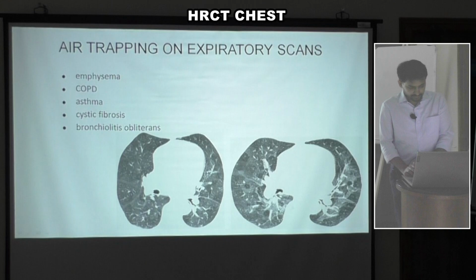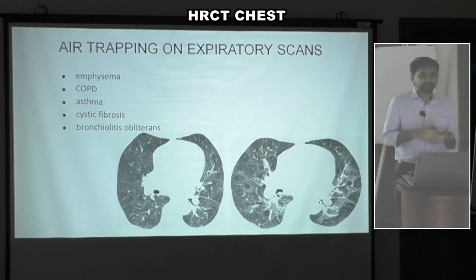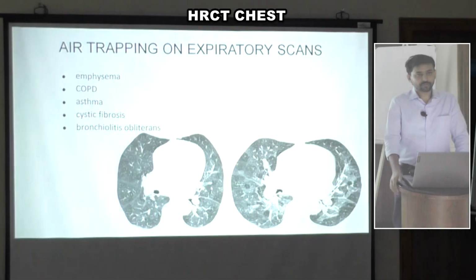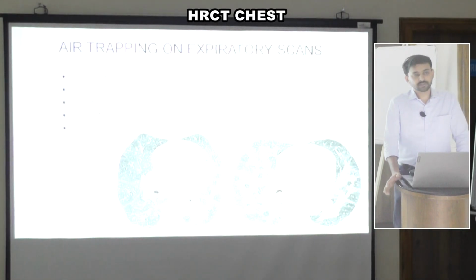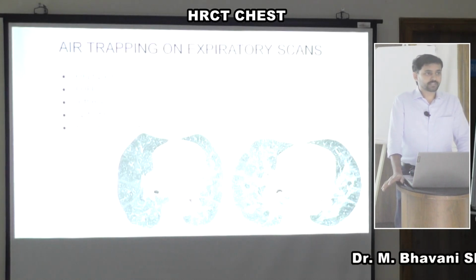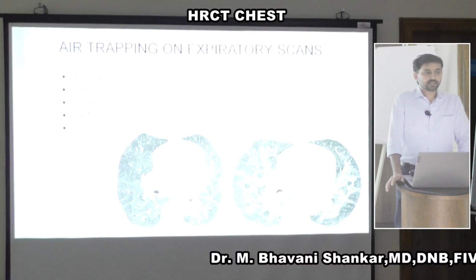With this slide I am concluding. The basic take-home message is basic anatomy, basic lobe identification, and basic mediastinal structure identification. Common conditions like ground glass opacities or consolidation patches, and the main pulmonary artery, you should be able to see, especially in suspicion of pulmonary embolism.